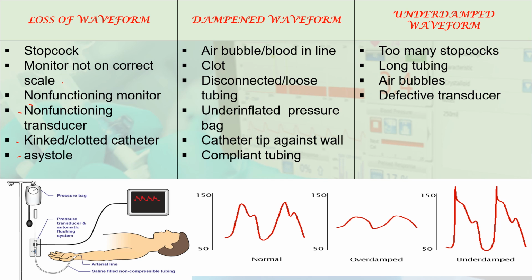I repeat it. First of all, the stopcock is closed, then monitor not on correct scale, non-functioning monitor or non-functioning transducer, and kinked or clotted catheter and asystole. Asystole in the sense absence of electrical activity in the heart. In these situations, the monitor shows loss of waveforms.